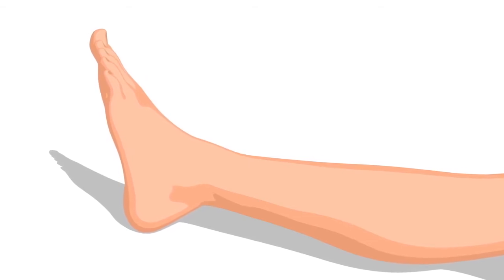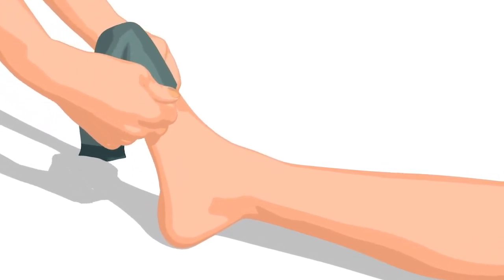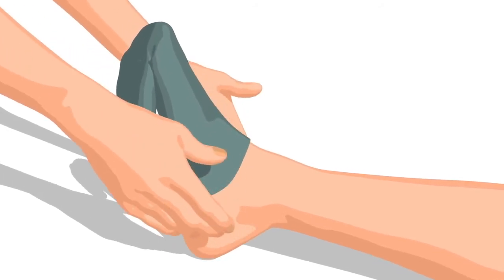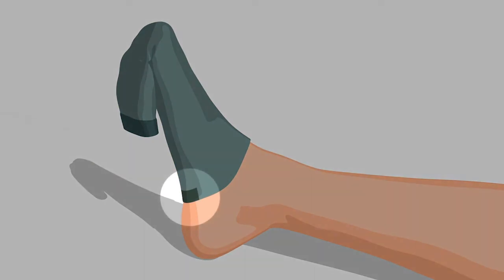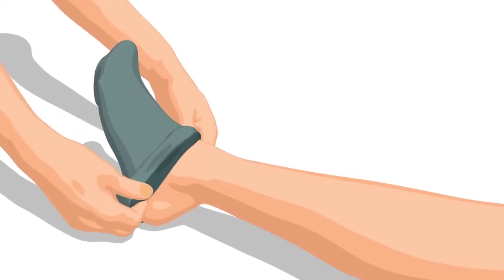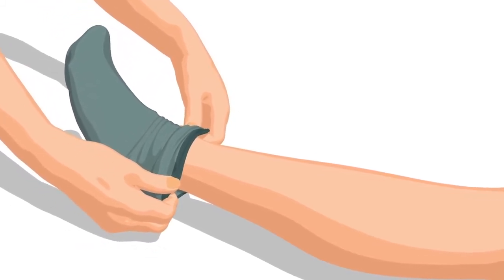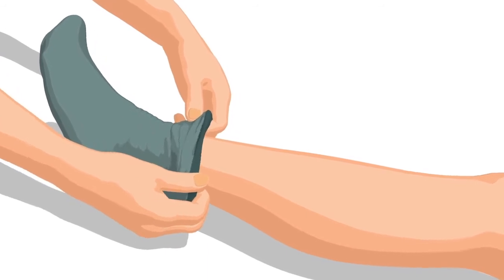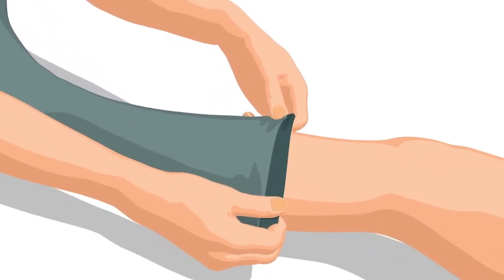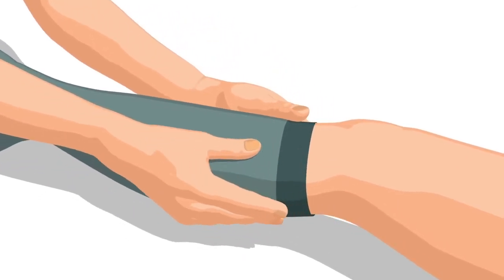Slide the stocking onto the foot, taking care not to catch toenails or hard skin. Ensure the heel is on the bottom and position the heel pocket correctly to ensure that the compression starts at the ankles. Taking hold of the turned-down garment, gently ease it over the foot and up the leg. Ensure all the material is eased over the heel area and that it's stretched from the ankle using a zigzag motion up the leg. Don't drag it up the shin and take care with fragile skin.